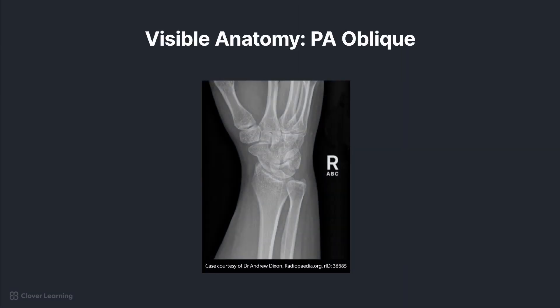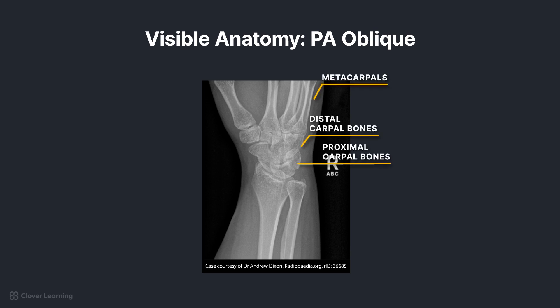Working from the most distal to the most proximal anatomy, we can still identify the proximal metacarpals, distal and proximal rows of carpal bones, as well as the distal radius and ulna. Note the slight superimposition on the medial aspect of the hand and wrist because of the external rotation.